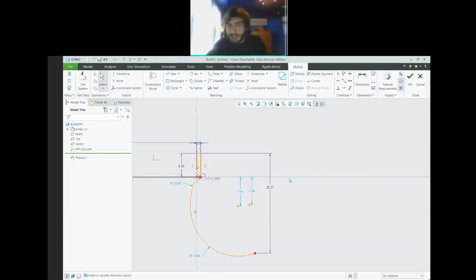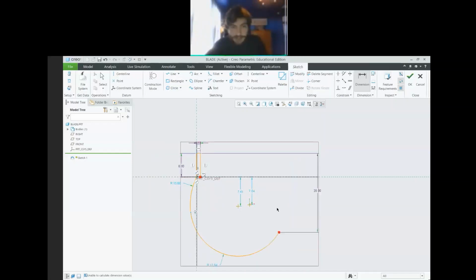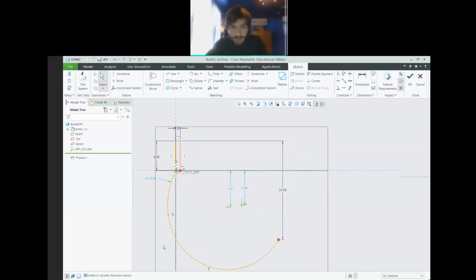If you don't click between them vertically, you would get that dimension, which is not what we're looking for. It's important that it needs to be between them top to bottom, not between them left to right. And we'll say it's something like 20 inches. That seems somewhat reasonable.